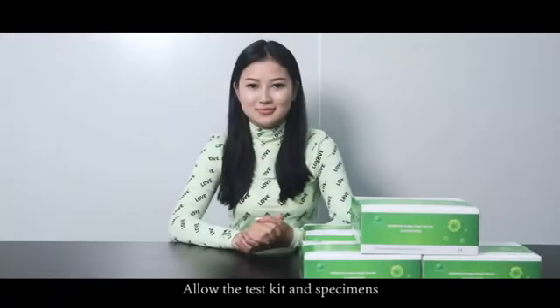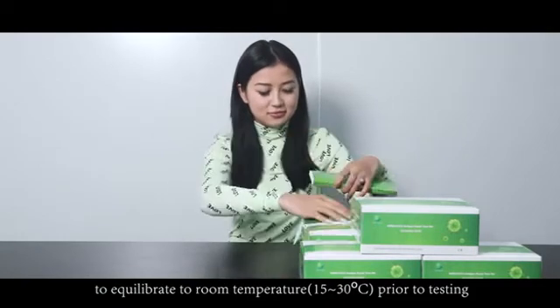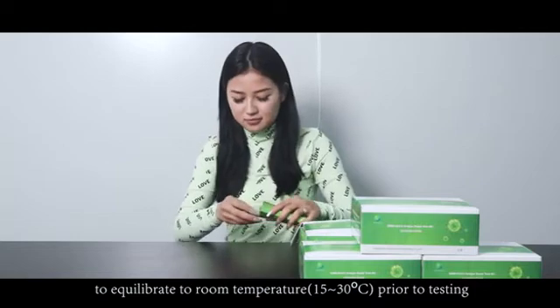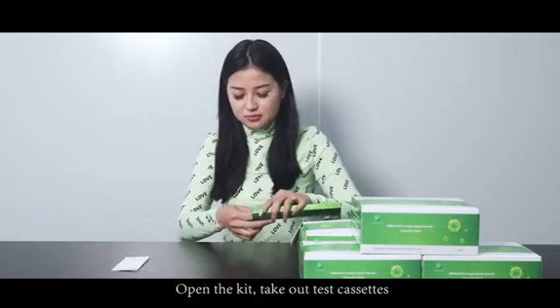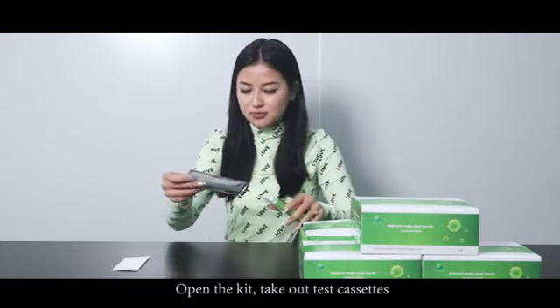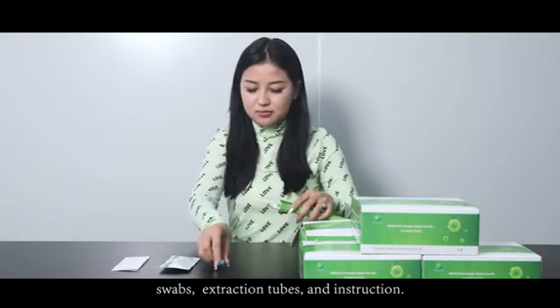Operation Guide of SARS-CoV-2 COVID-19 Antigen Rapid Test. Allow the test kit and specimens to equilibrate to room temperature, 15 to 30 degrees Celsius, prior to testing. Open the kit and take out test cassettes, swabs, extraction tubes, and instructions.